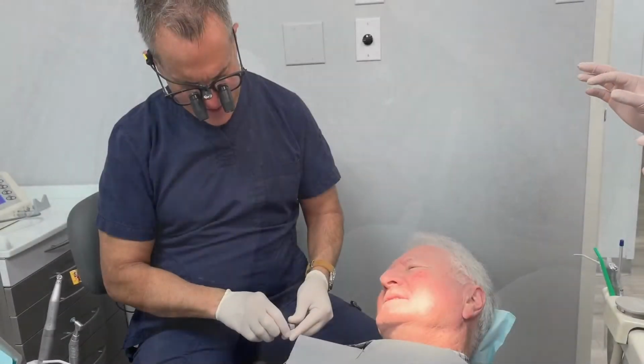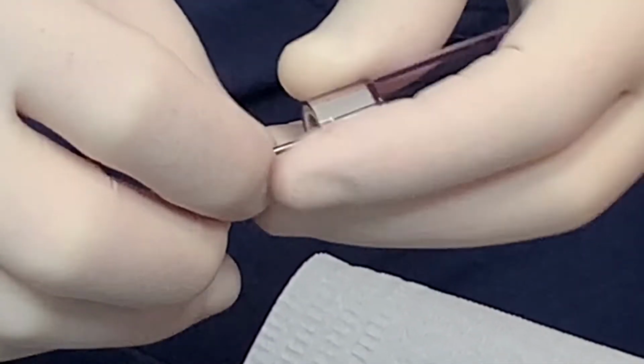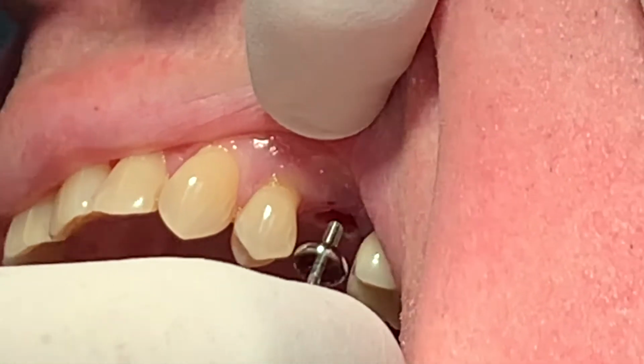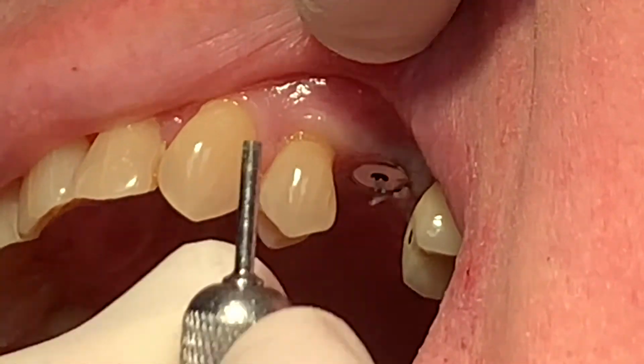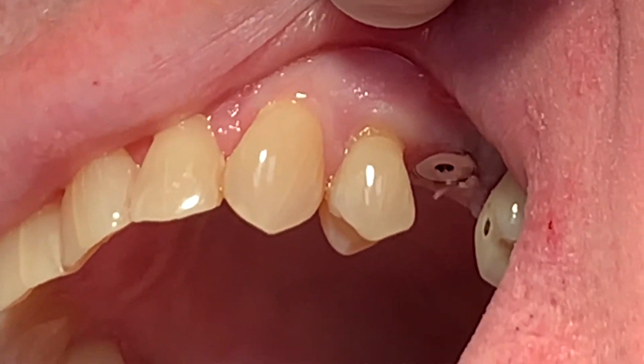Okay, per Dr. Nisnik's request. So Implant Direct implants come with a healing cap with a tissue collar, which is very much affixed to the bottom of the... They don't want to come out. Yeah. Let's see. It looks like that. Turn your head towards me. And there it goes. You can see that we're right at the level of the tissue. Okay. Right at the level of the tissue. Beautiful. All right. We're going to go with that? Yes.